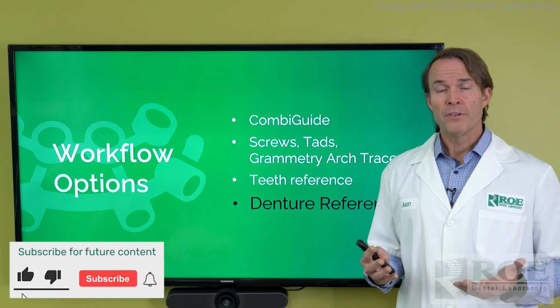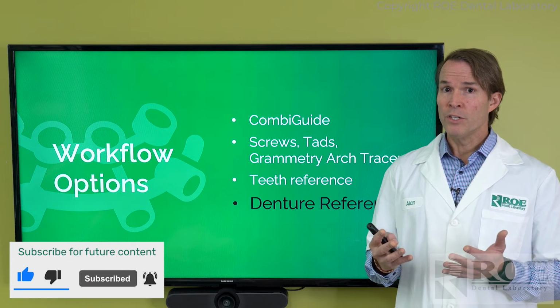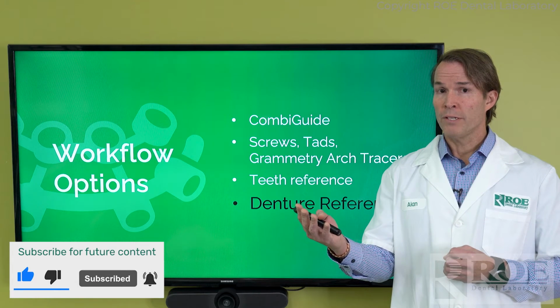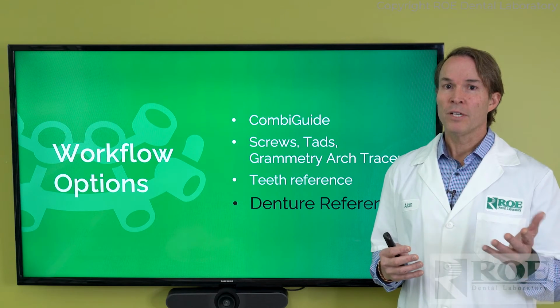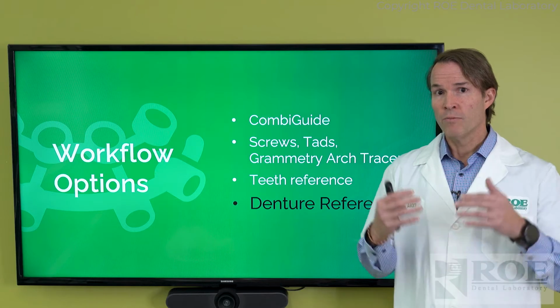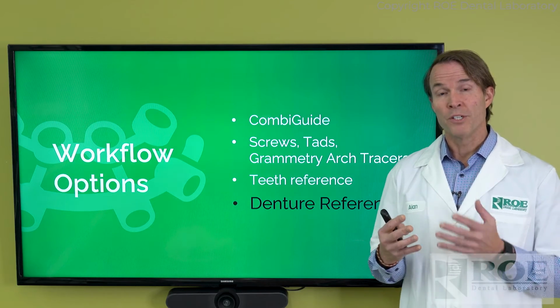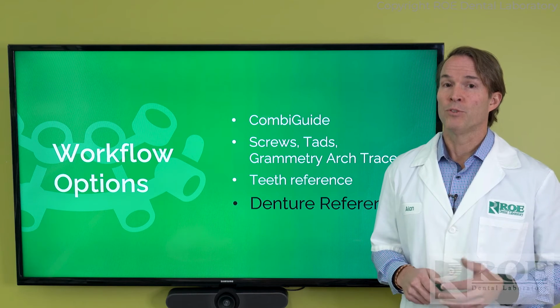And then the final modality for today is the denture reference. This is something that is commonly used either in an immediate situation, right, immediate denture, or in an existing case, where the patient has a denture, goes right into surgery and you use this as the record for the bite, the teeth, the tooth position. Really, that's a nice way to set yourself up for success with these cases, especially restoratively.